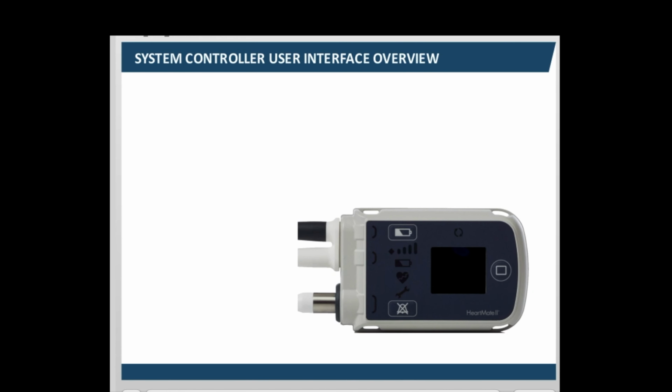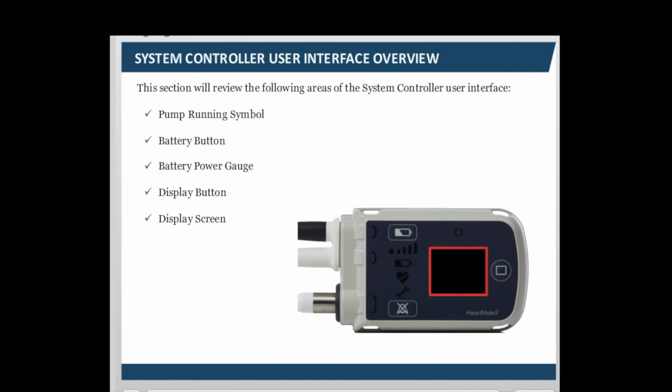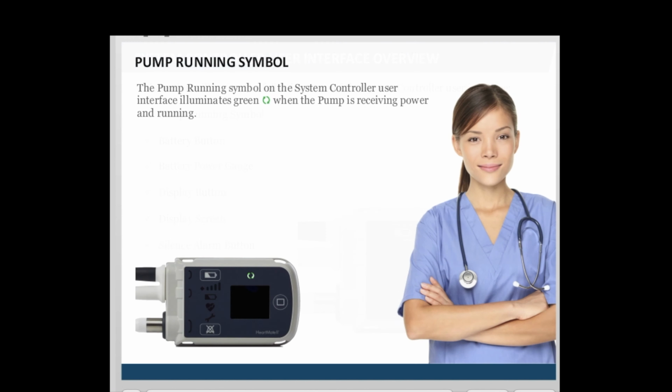The front panel on the system controller is the primary interface for users during routine system operation. In this section, we will review the various functions and status symbols on the system controller user interface, including the pump running symbol, the battery button, the battery power gauge, the display button, the display screen, and the silence alarm button. The pump running symbol on the system controller user interface illuminates green when the left ventricular assist device is receiving power and running.